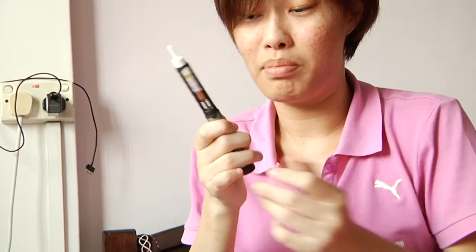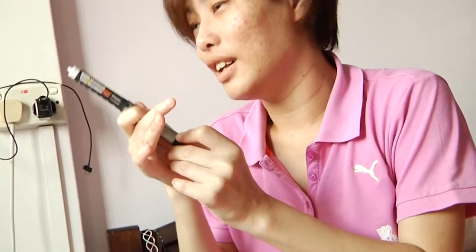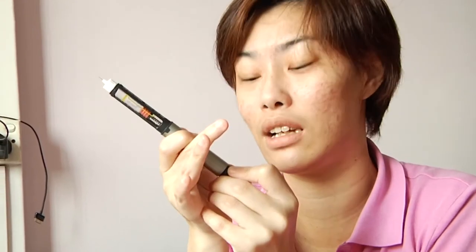My belly. Yeah, you don't feel me. Relax. 16.8, 16.2, 16.9. Wow, very high. Very high. This is how I listen to my dosage by clicking.